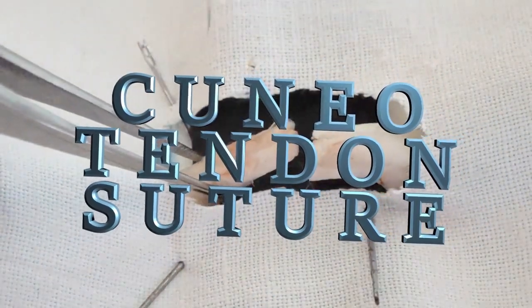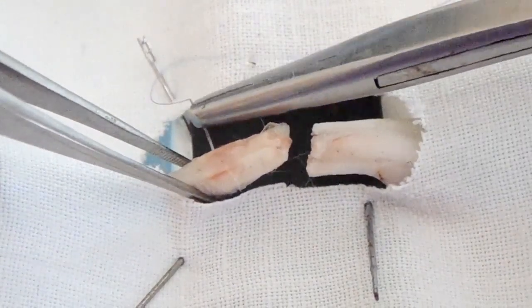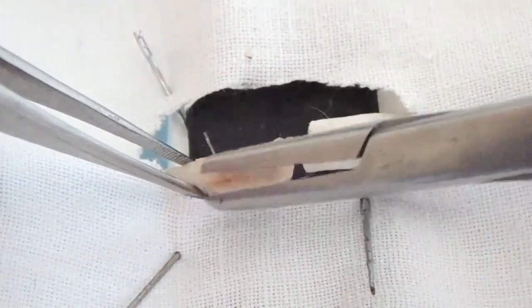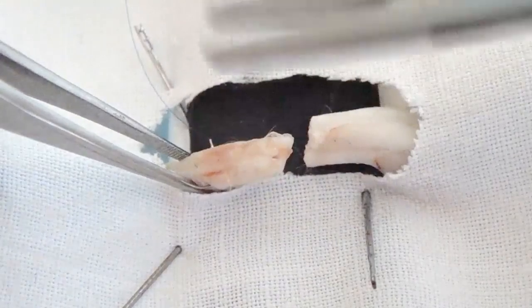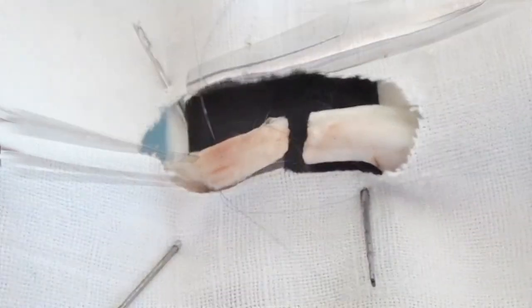The filament with needles on both ends is used for this purpose. One of the ends of the tendon is sutured with an atraumatic needle in a transverse direction at the distance of 1.5 cm from the injury.